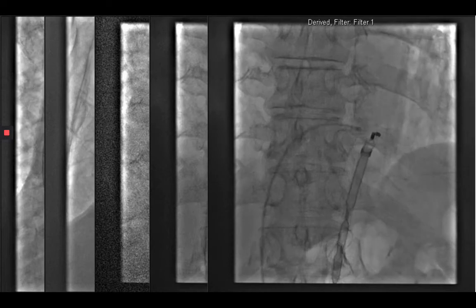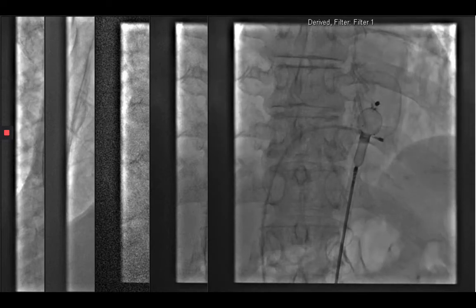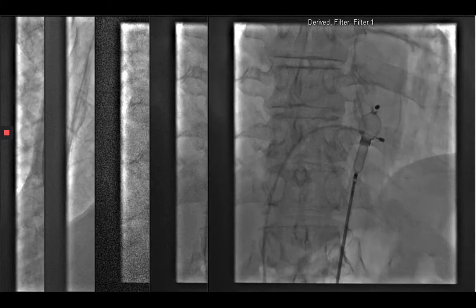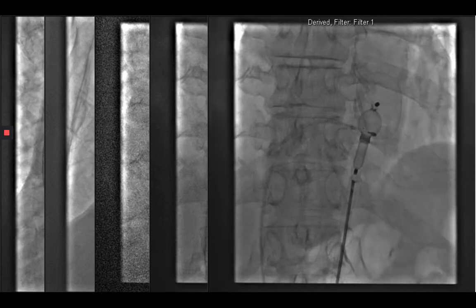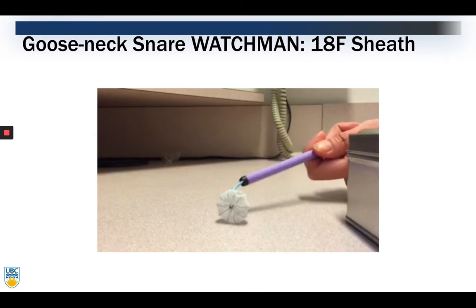As you can see, this is achievable and complex. And there was no issue with the aortic valve. The patient was very stable beyond the 3rd-degree AV block.